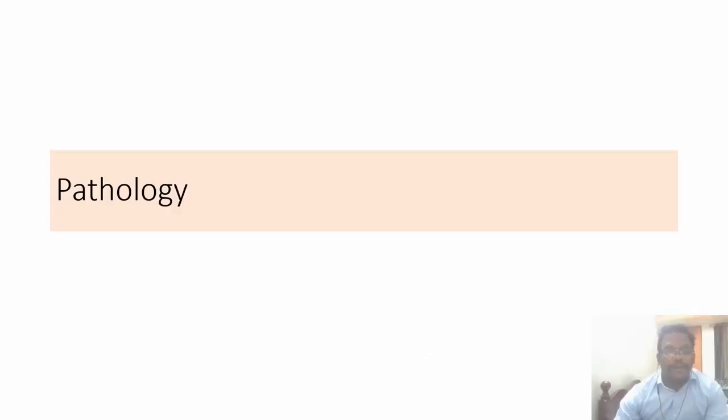So let us move into pathology. Here we are going to see examples for all 5 views of EFAST positive.